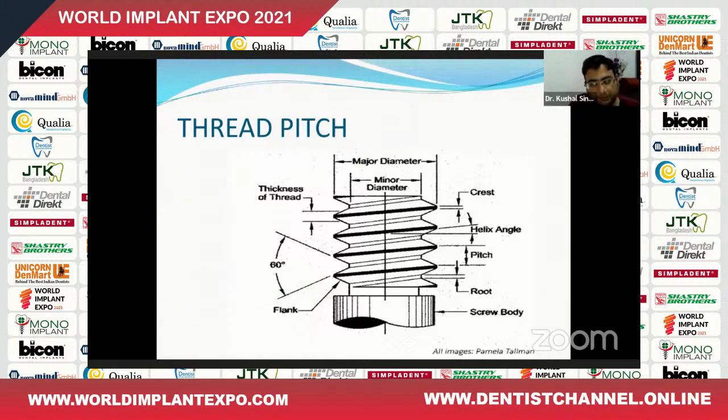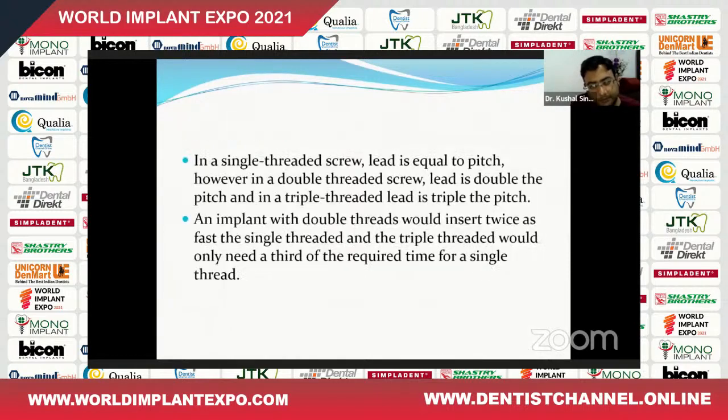Okay, next. Now the thread pitch. This is the diagram of thread pitch. Here you can see the pitch, and the distance between the roots of the threads is known as the pitch distance.